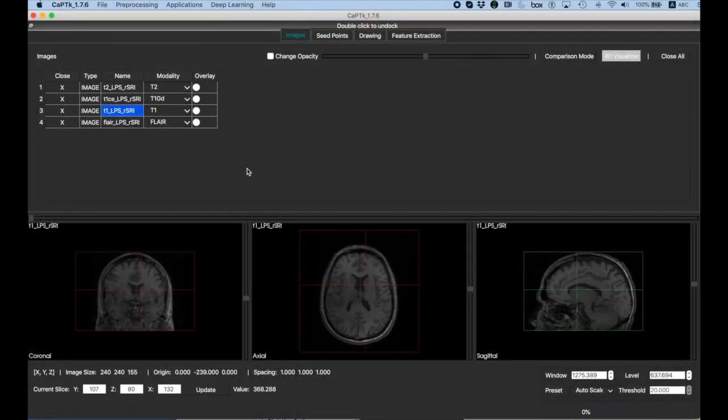Here, I have opened CapTk on my Mac and loaded four structural modalities: T1-weighted, T1-weighted with contrast, T2-weighted, and FLAIR from a single patient.